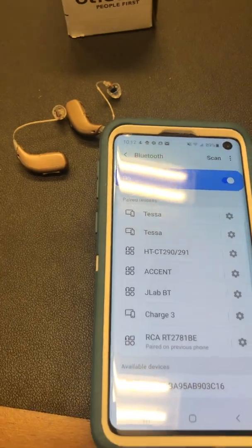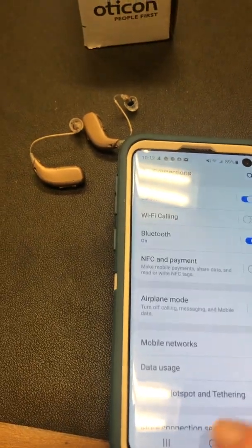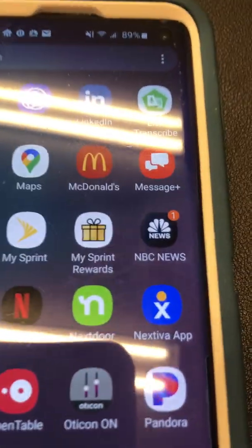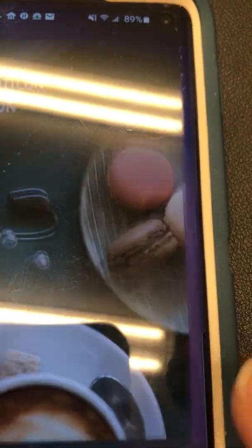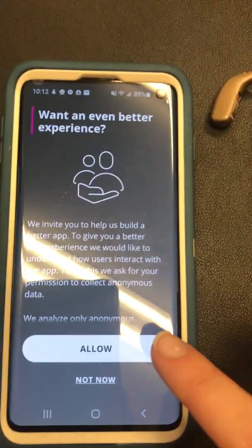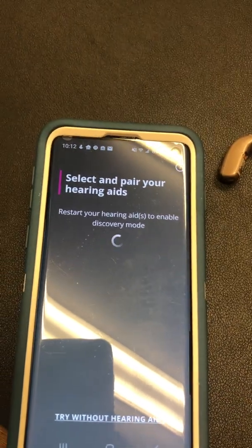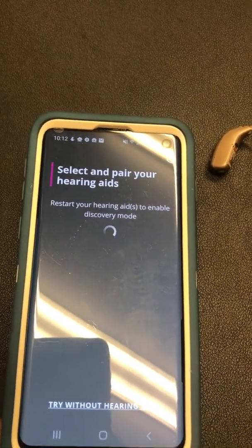Once they are Bluetooth connected to your cell phone, you're going to go to the Oticon On app. Click that and it will start to walk you through. You're going to allow and it's going to try to search for your hearing aids.